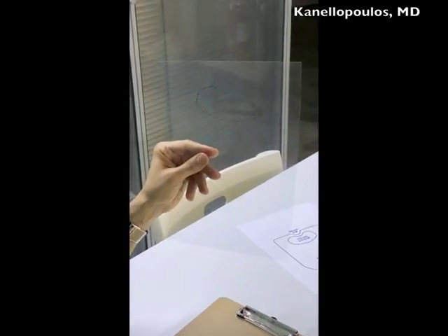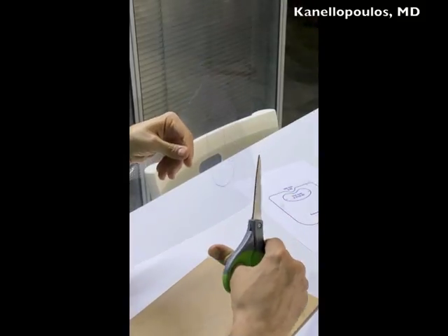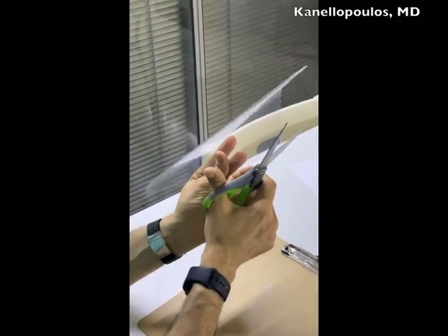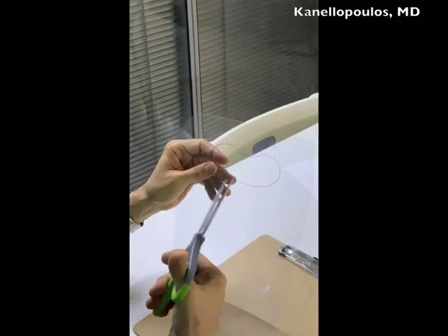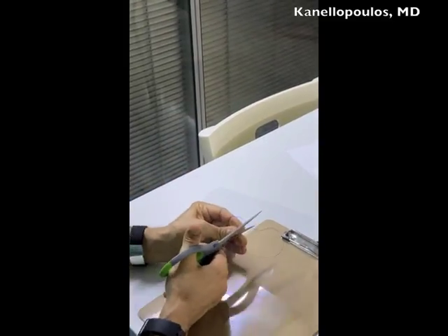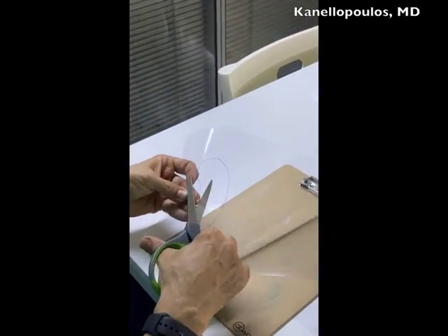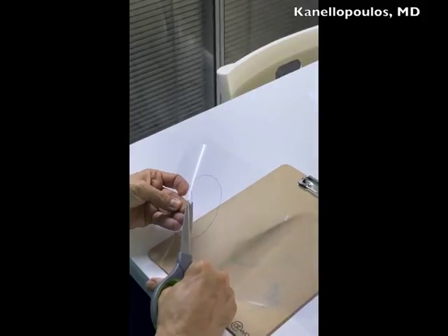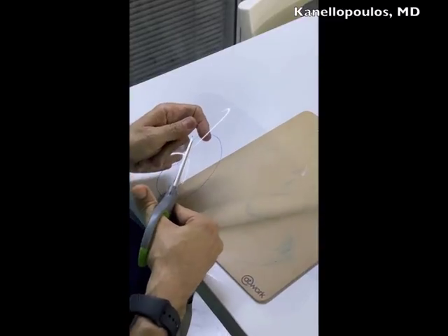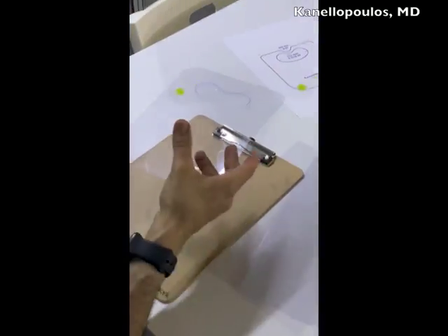And now by taking the opening that you need to do, all you need to do is round up the corners to avoid any accident, somebody hitting their eyes on it. So we're rounding up the corners. And then we're just gonna enter this area here to create our predetermined opening. So we're gonna go in with our scissors. Actually, if you have kids at home, this would be a great exercise to do at home. And we're gonna go around to cut this the best possible with our scissors and to create our final product.